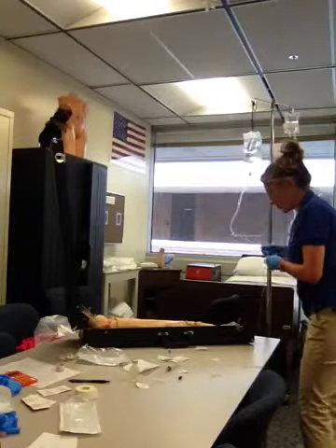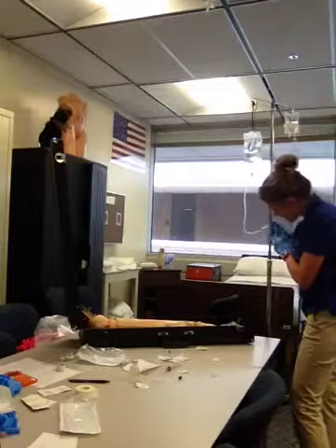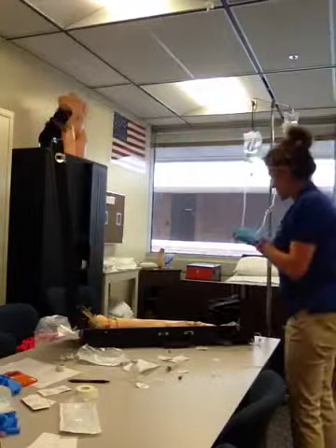Do we use the water cup? When are you supposed to in real life? Click the primary line.